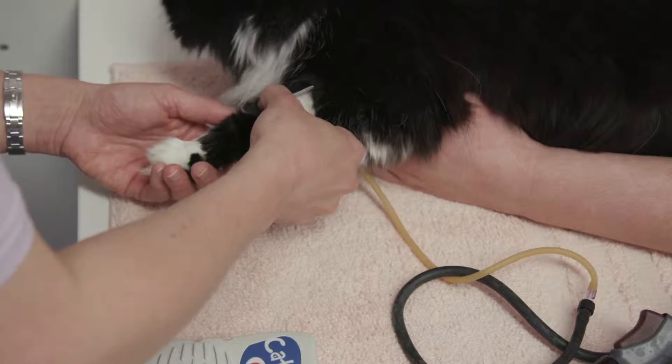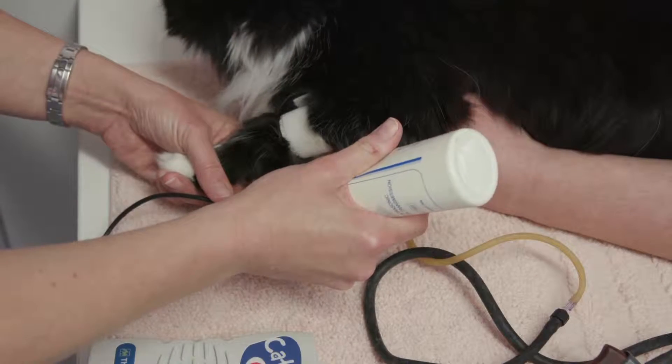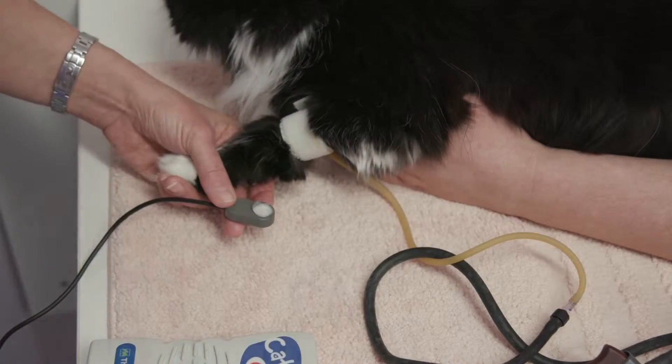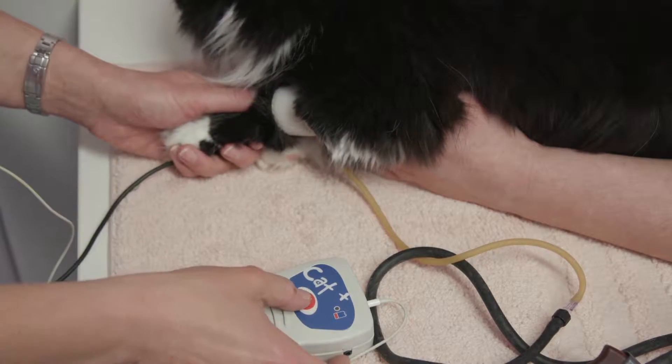We're then going to place some ultrasound gel over the common digital artery and also directly onto the probe of our Doppler blood pressure machine, and using just very gentle pressure, listen for a pulse signal.